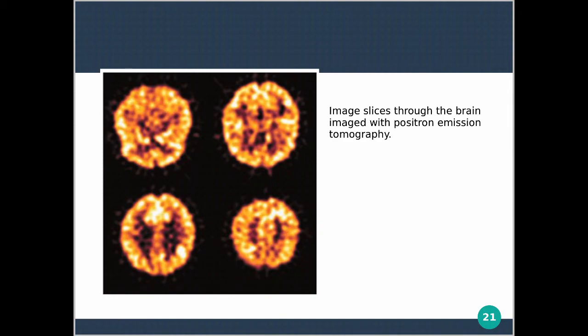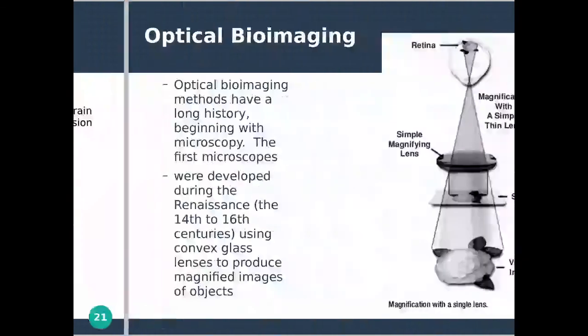That part is usually very active because there's a lot of blood supply there. So you cannot really distinguish much of the actual structure, but only where the radioactive molecules can pass through in that tissue. That is why a PET scan is usually done in tandem with structural MRI, or even superimposed onto a CT scan image, so that you will know in which part exactly the signal comes from.